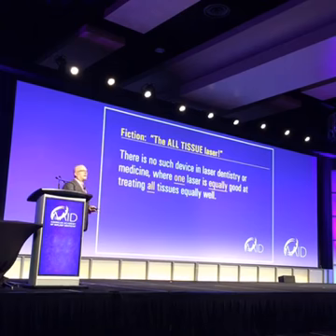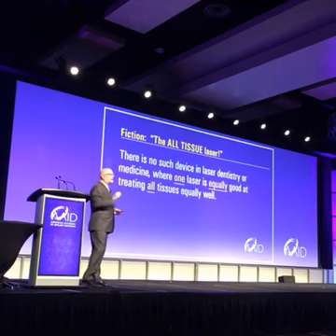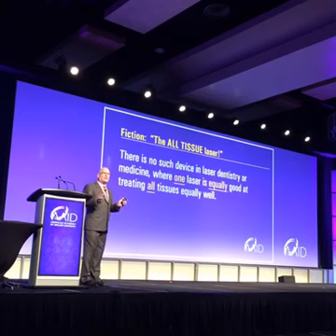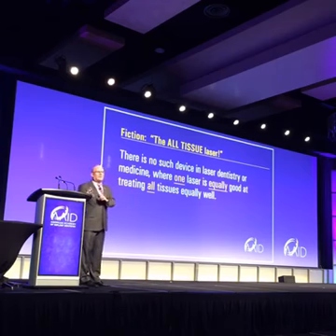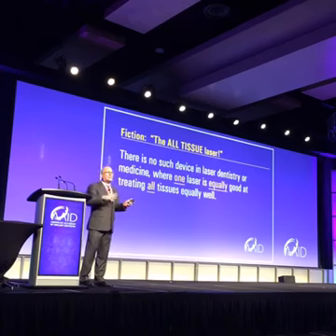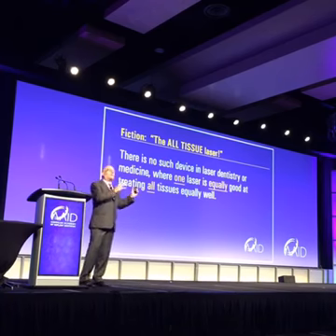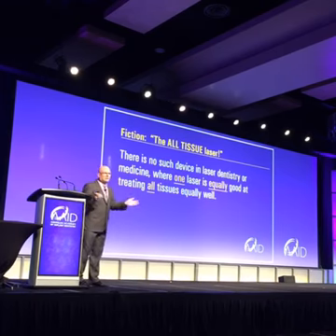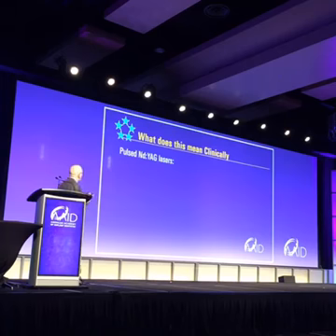There is no device in laser dentistry or medicine where one laser is equally good at treating all tissues equally well. That's important. Before you buy a laser, you have to look at what you want it to do. If you want it to do one thing, don't expect it to do another procedure really well. So if I want a laser that cuts bone, it's not really going to do as well treating perio, which we're going to see. So one laser can't do everything equally well. Very important. So what does it mean clinically?